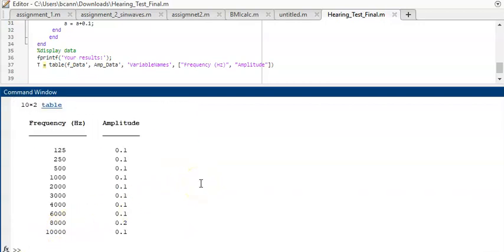Once they finish the hearing test, they're transferred to a table which shows them the amplitude that they heard each of the frequencies that they listened to during the hearing test. This table would then be interpreted by an audiologist.